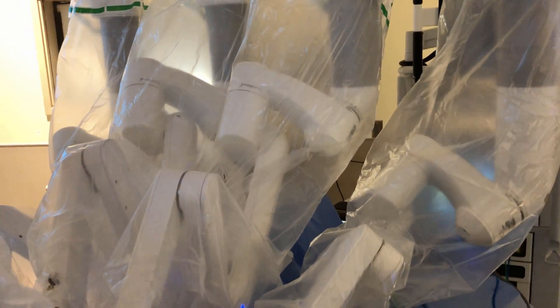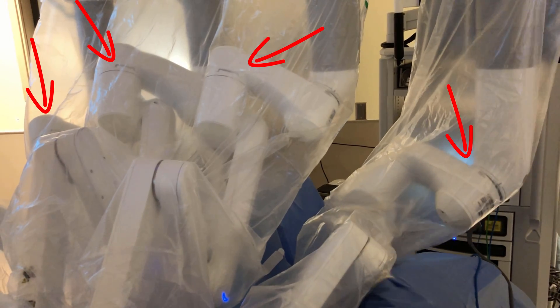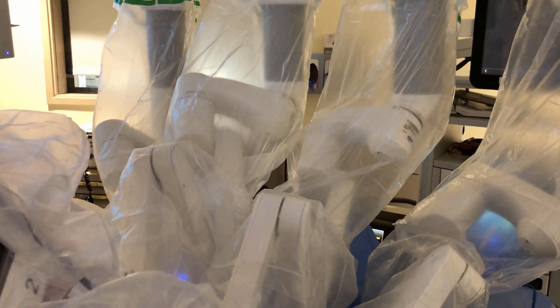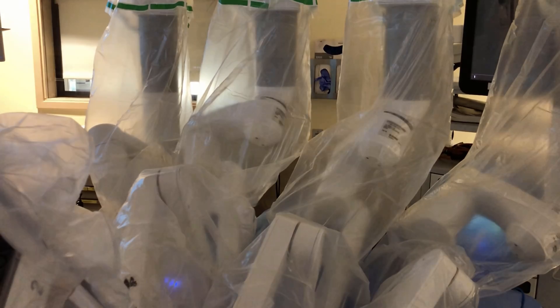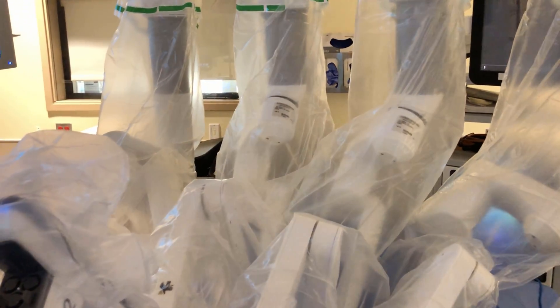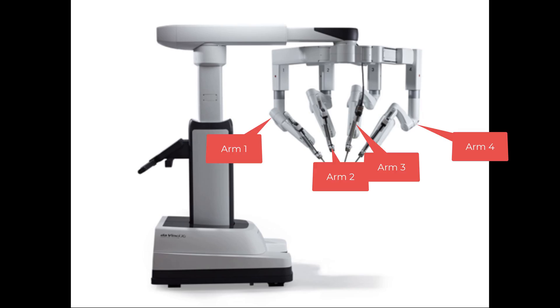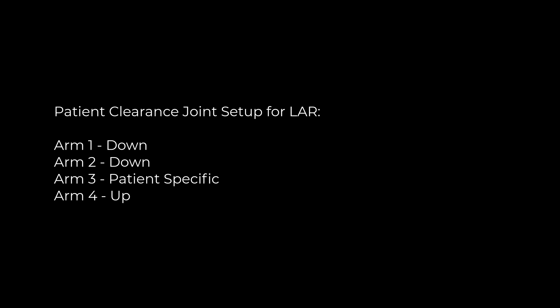Moving down the robot, the very next thing you'll see are the patient clearance joints. In general, you want those to go down as far as possible without hitting the patient. On pretty much all cases — whether right colectomies, left colectomies, low anterior resections, or whatever — arms number one and two go all the way down, arm number four is usually all the way up because on a LAR you'd hit a knee, or in a right colectomy you'd hit the head if you go too far down, and arm number three is plus or minus depending on the spacing of that case.